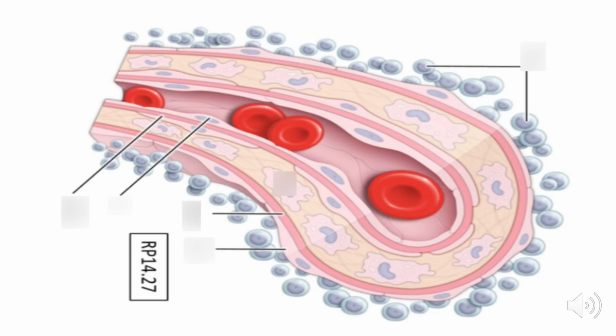So, let's apply the concept on this particular picture. First is the endothelial cell of the blood vessel, then its basement membrane. Then you have here a thin perivascular tissue space. This is the basement membrane of the type 1 epithelial reticular cells of the thymus. These 5 components are making up the blood-thymus barrier.